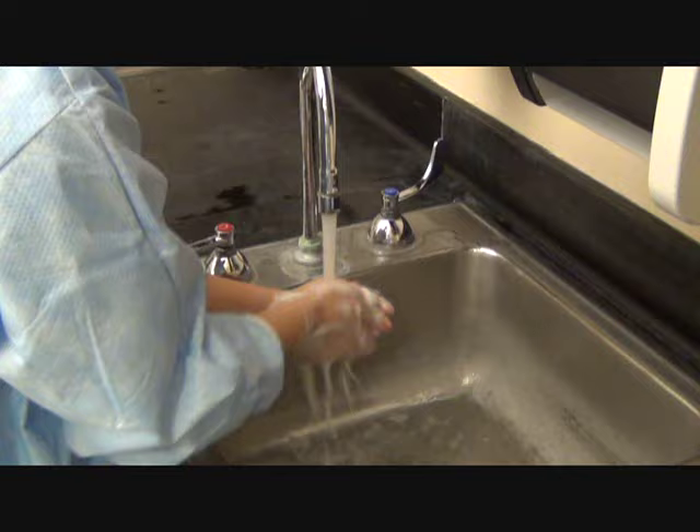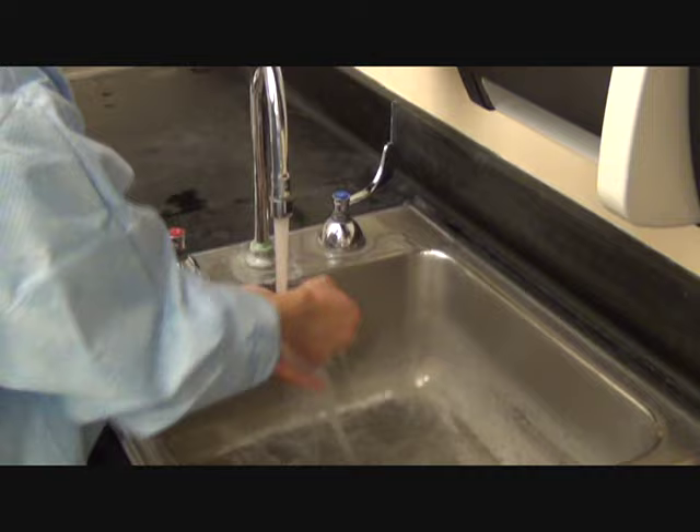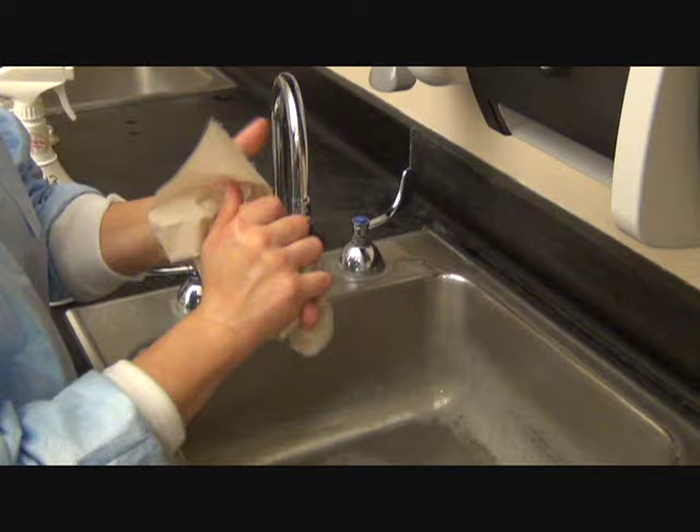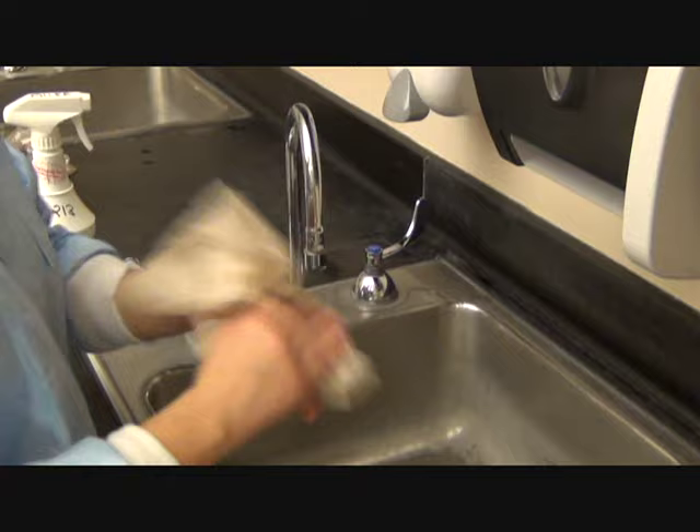You want to wash for at least 15 seconds and sing ABCs or Happy Birthday to yourself. You don't want to touch the sink with your hands because you contaminate them. Make sure you have a paper towel ready to go, and fully dry your hands, otherwise it will be hard to put on the gloves.